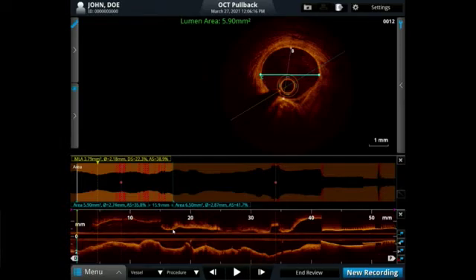Some nitro, please. This is very important. I totally agree with you, because this is what happens sometimes for us. Perfection can be the enemy of good. Exactly. So, do you think we need another balloon now? No, I think no. Stent. You've changed the vessel compliance with the Shockwave at low pressure, so you've got 4 atmospheres, 6 atmospheres. If we need a balloon, we can do it post the same way. Afterwards is okay, but I would put the stent in, 100 IC nitro, and then do an OCT, and if the areas are good, the stent is apposed, then nothing more needs to be done.